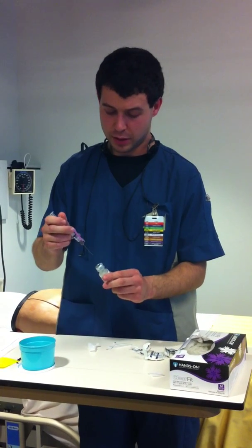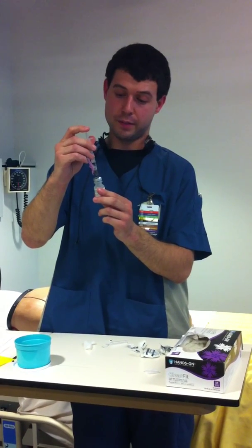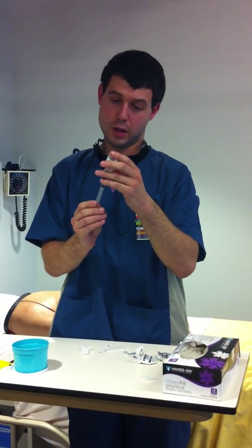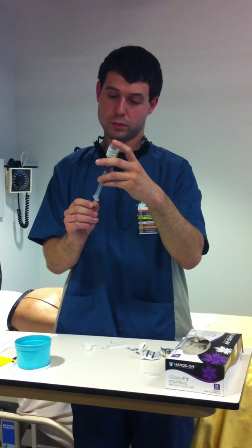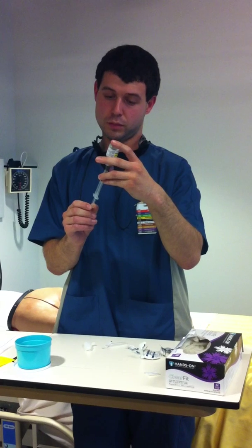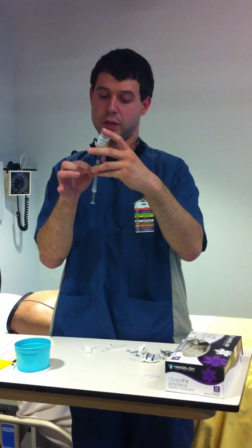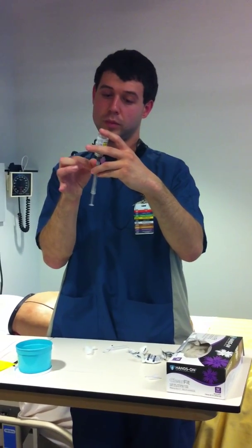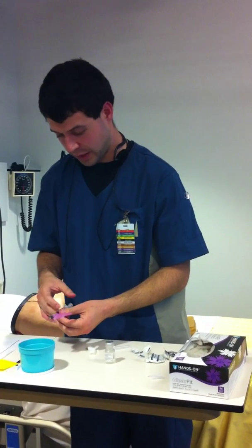And I'm going to aspirate this amount of air into the air portion of the vial. Okay, now I can begin to withdraw the medication. If there's any air bubbles, knock the syringe side till they reach the top. Okay. Now, eject any excess medication.